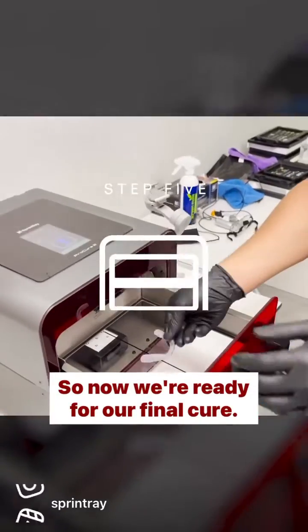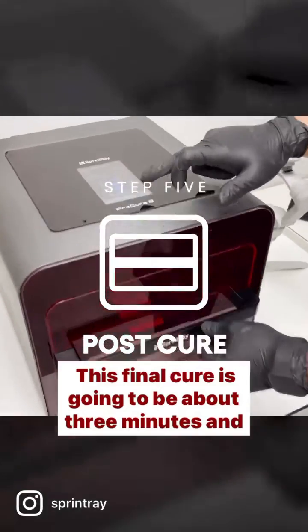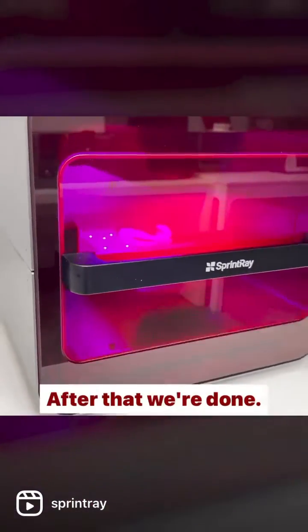Now we're ready for our final cure, and this final cure is going to be about three minutes — and that's about it, after that we're done.